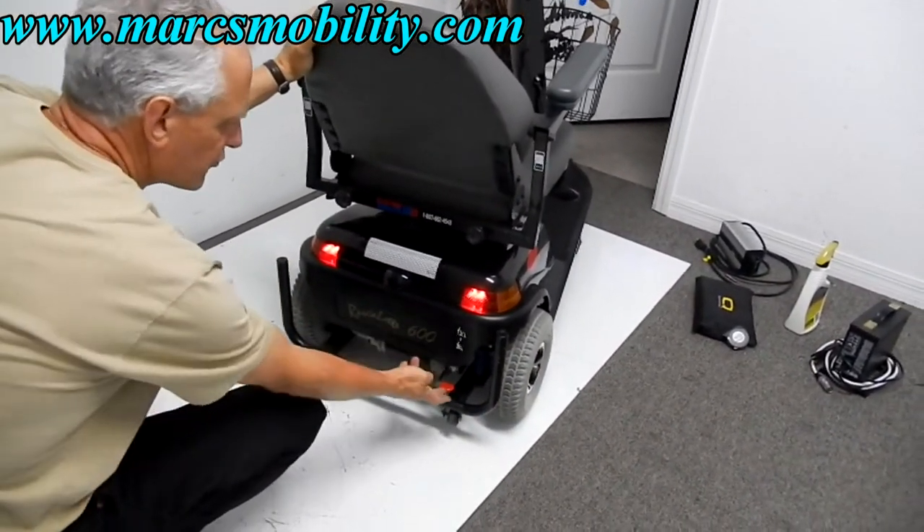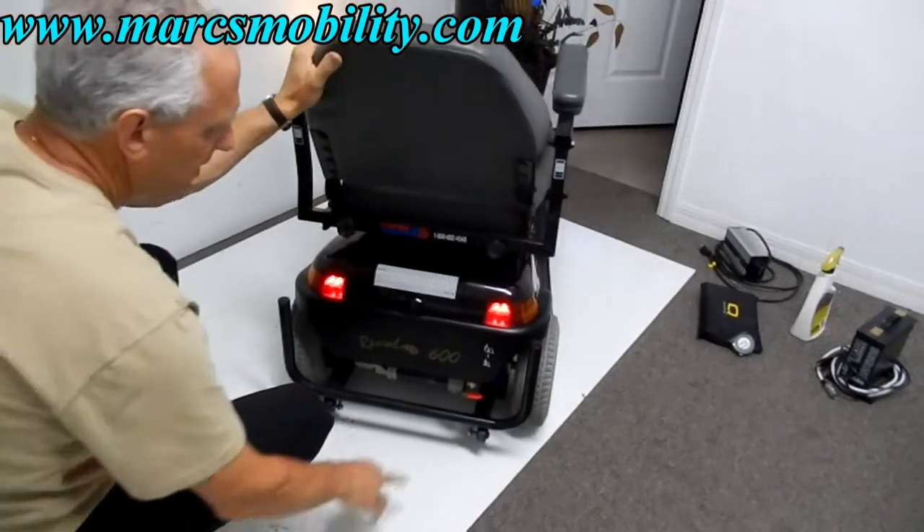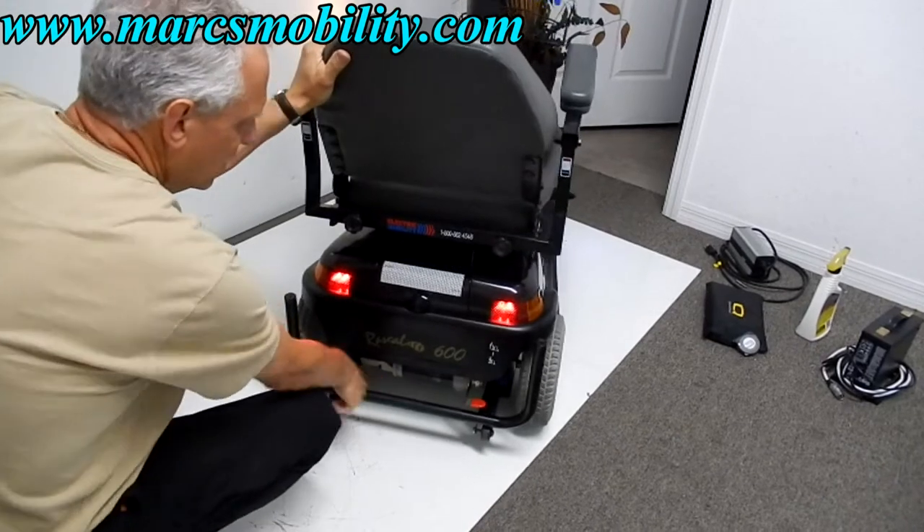If you ever need to put the scooter in neutral, take this lever, push it up and you're in neutral. Push it back down and you're back in gear.